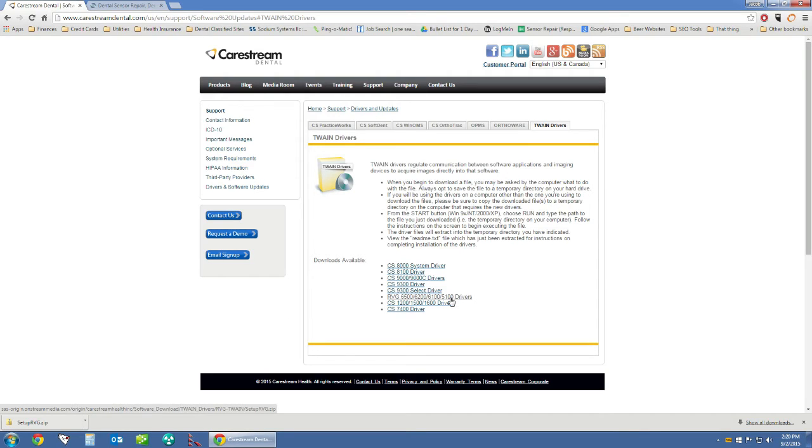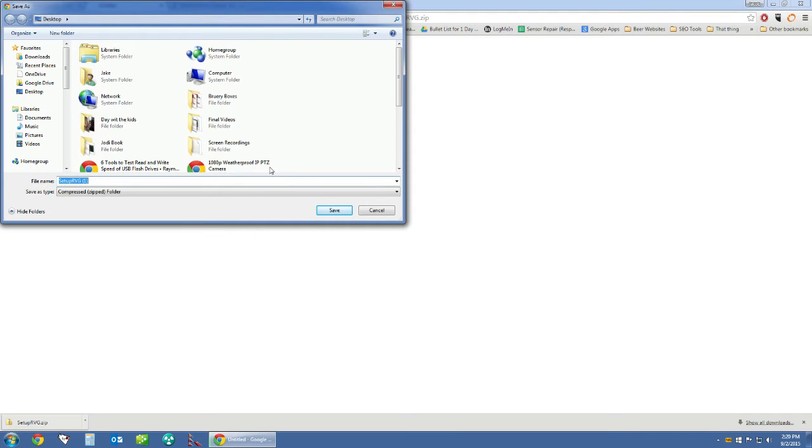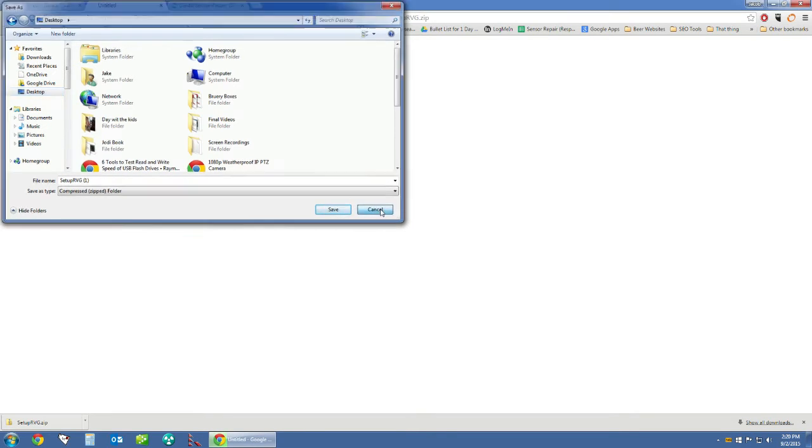Click that link. It will prompt you to choose a download location. We want to choose a location that is convenient — the desktop would be great. Click on desktop and then click save. It is a fairly large file so it may take 5 to 10 minutes to download depending on your internet connection.